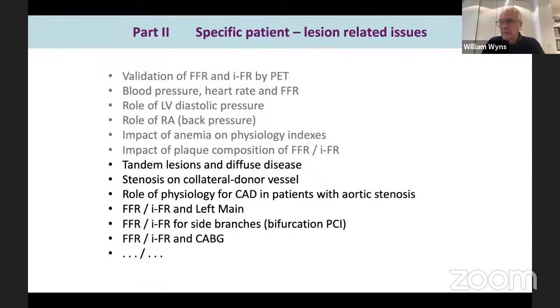And perhaps a little atropine or something, if the bigeminy is associated with bradycardia, maybe you need to do something about it to try to have a stable heart rate and at least be able to measure during 3 or 5 consecutive normal beats. Okay, great. Tony?